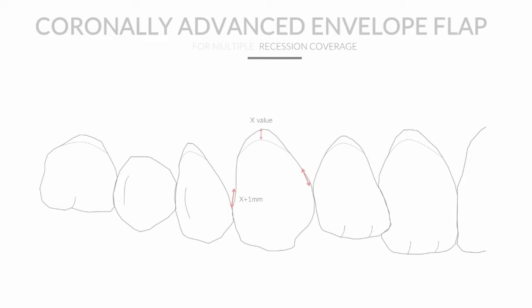The oblique incision is made starting from the apical margin of the adjacent teeth and ends in the previously determined endpoint. Once we complete this step, we have created, apically to the incision, a couple of surgical papillae. The remaining papillary tissue coronally to the incision is now called an anatomical papilla.